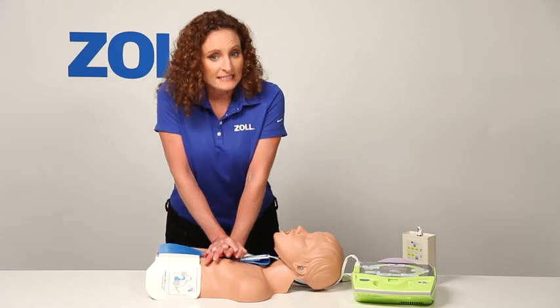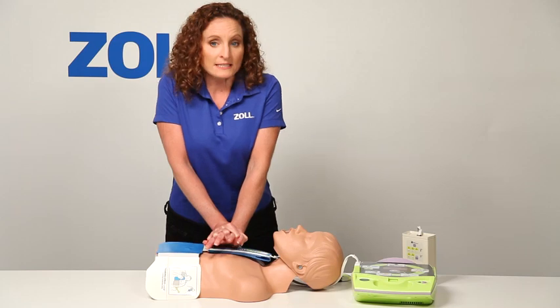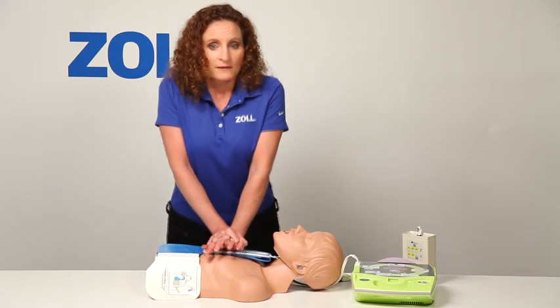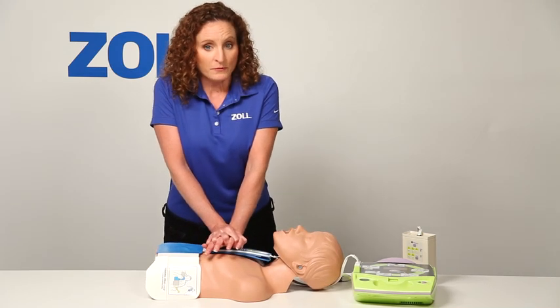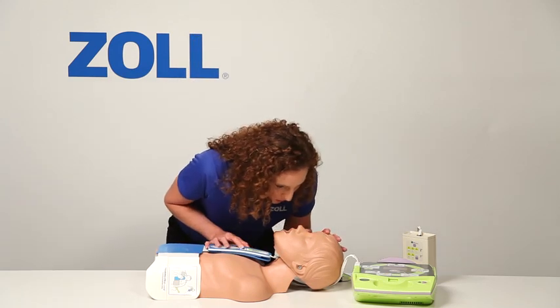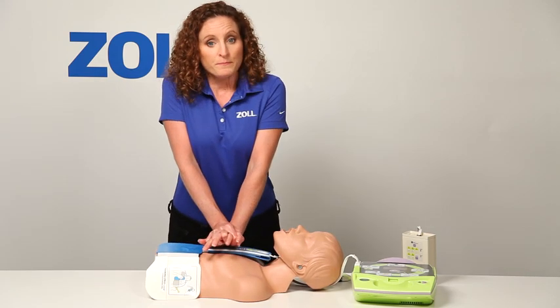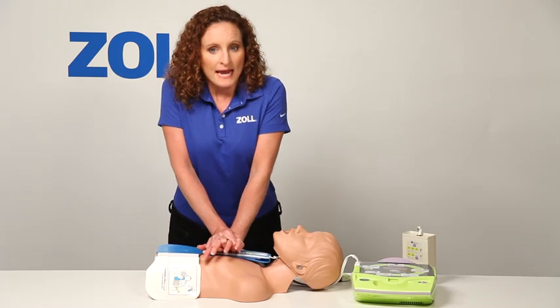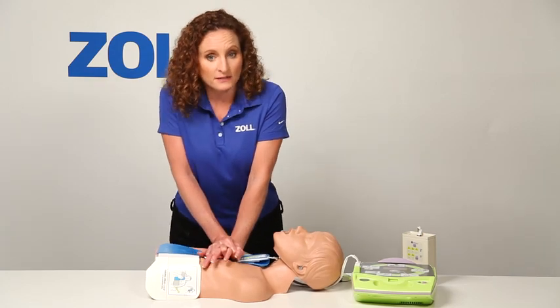The 2010 American Heart Association guidelines for CPR recommend a compression-to-ventilation ratio of 30 to 2 for trained lay rescuers. Untrained lay rescuers can provide hands-only CPR. If you do stop compressions, like I am now to give two breaths, the metronome stops. When I start back up, the beeps begin again and are synchronized to my compressions, speeding me up to at least 100 compressions per minute as recommended by the American Heart Association.